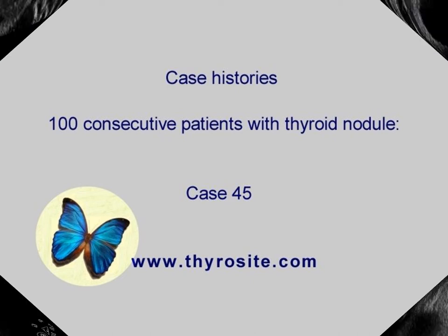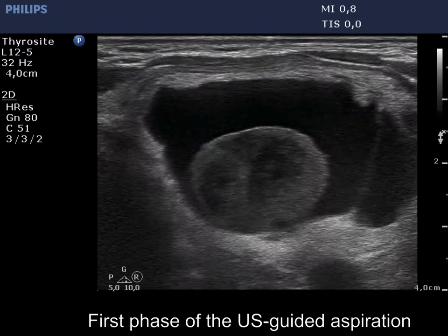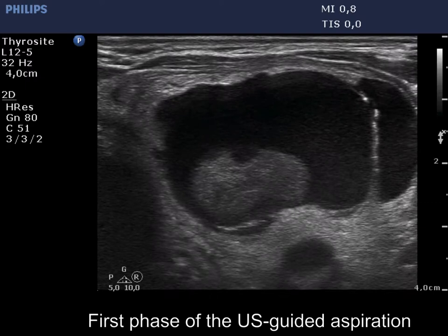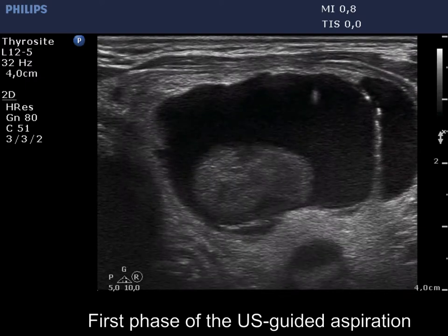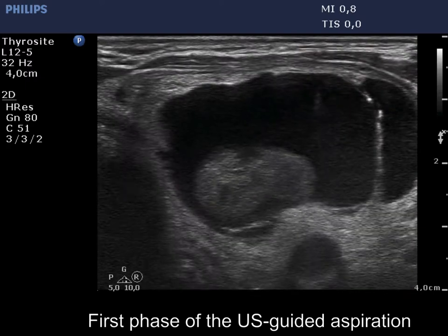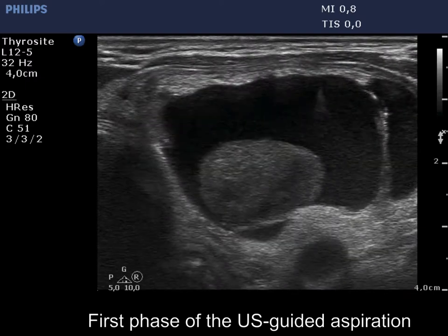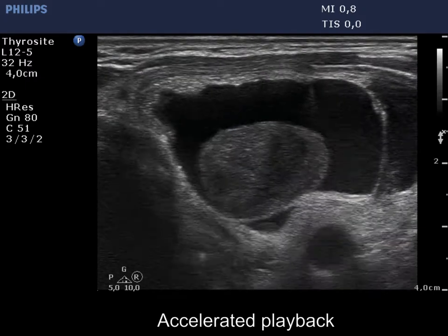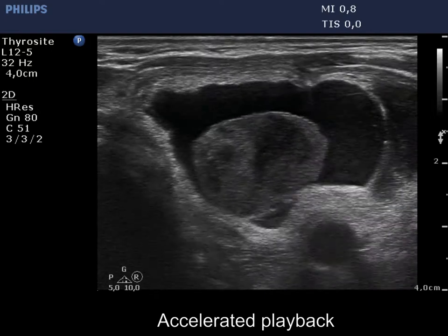The first session of an ethanol sclerotherapy is presented in the video. First, we locate the needle in the middle of the field of vision. The tip can be clearly seen.